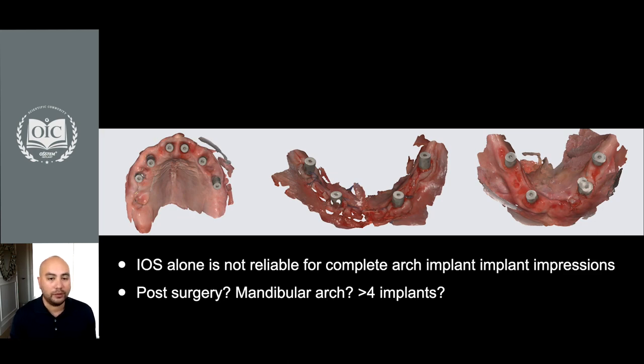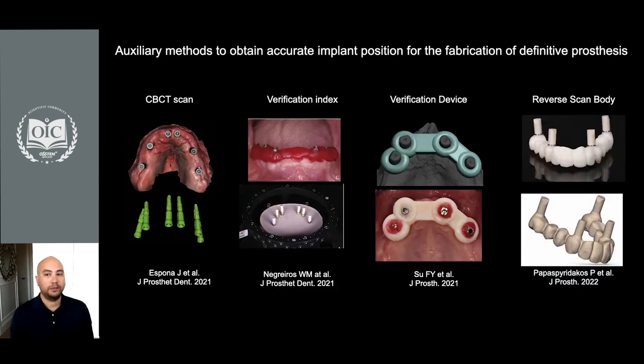These are not always easy to achieve. So auxiliary methods have been introduced to obtain much more accurate implant impressions for the fabrication of a definitive prosthesis. I summarize here what's been recently published.